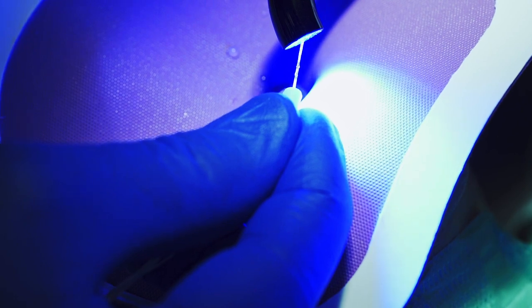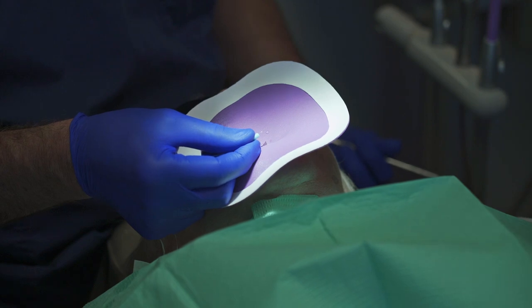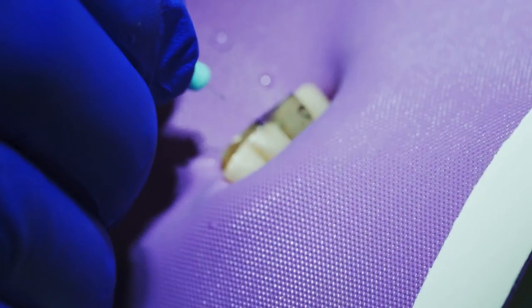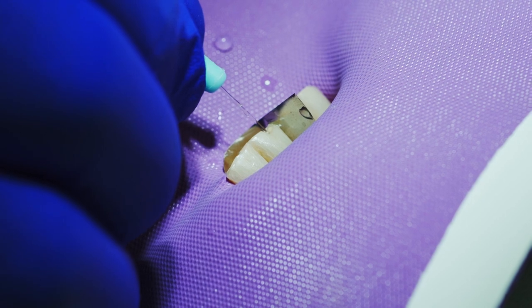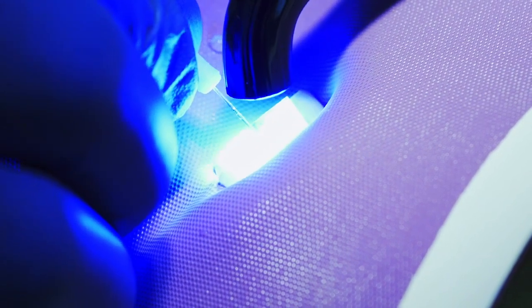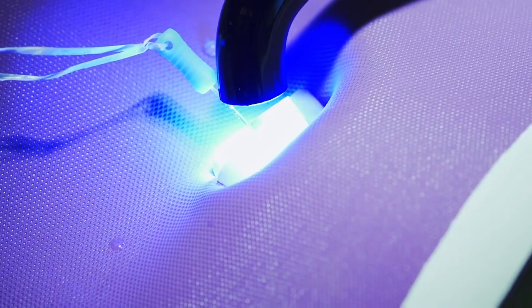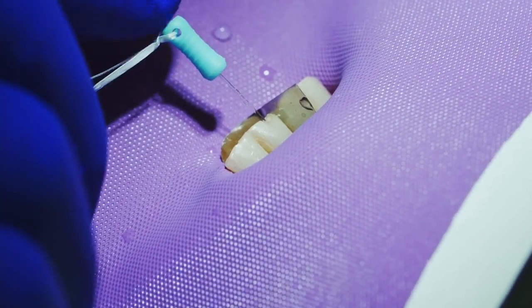Either way works great. I'll have my assistant put a little dot right on the tip of this, and then I'll insert it two millimeters into the tooth itself, and then we'll cure it. One of the advantages of this fiber optic fiber is it takes the light and transmits it to the base of the preparation, so my curing depth is deeper as well.